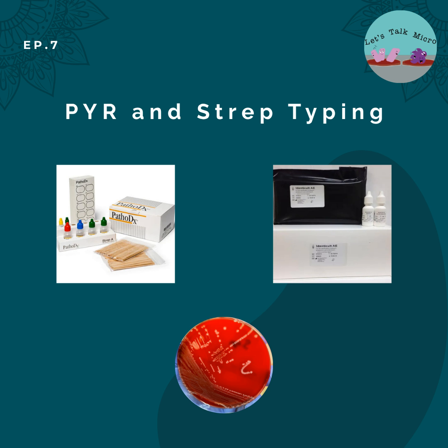Sometimes you don't have that much growth, especially if you're doing a urine culture. Most protocols require you to rule out beta strep in females between, let's say, 9 and 49 years old, what's considered childbearing age. Because if the female has beta strep in the vaginal canal, then the baby can get it and become septic. And it's pretty common in OB patients. I'm not exactly sure at how many weeks of gestation they get tested for beta strep.